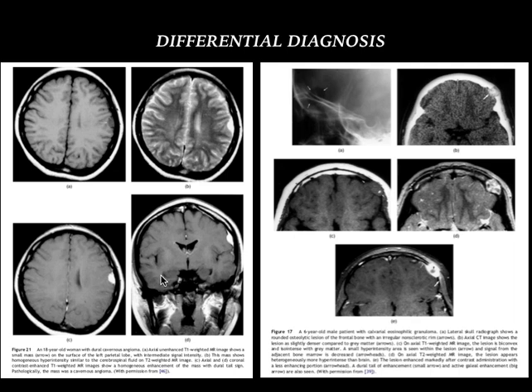This is again, if you look at the appearance, an extra-axial lesion, well-defined, showing a dural tail, which is clearly seen even in the coronal post-contrast T1-weighted images. Imaging-wise we would give it as a meningioma, but this is a proven case of dural cavernous angioma.